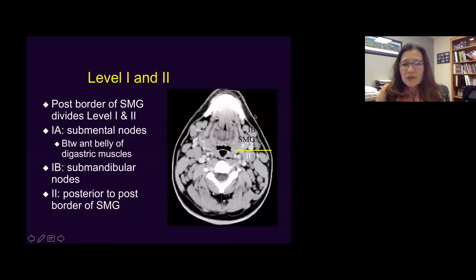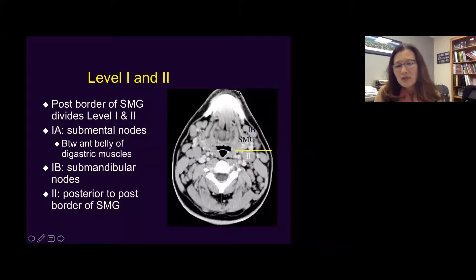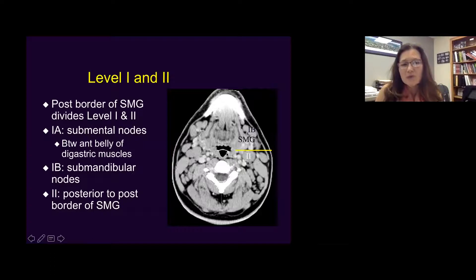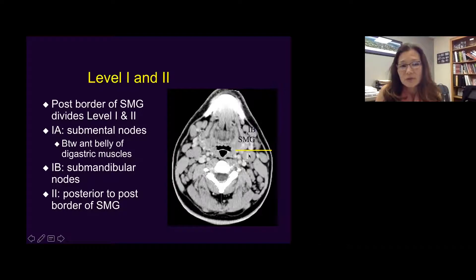This is an imaging example of classic cross-sectional head and neck imaging. The posterior border of the submandibular gland, marked with a star sign, is the division of level one and two. Any lymph node posterior to the submandibular gland would be level two lymph nodes. Anterior to that and lateral to the anterior belly of the digastric muscle would be level 1B nodes.